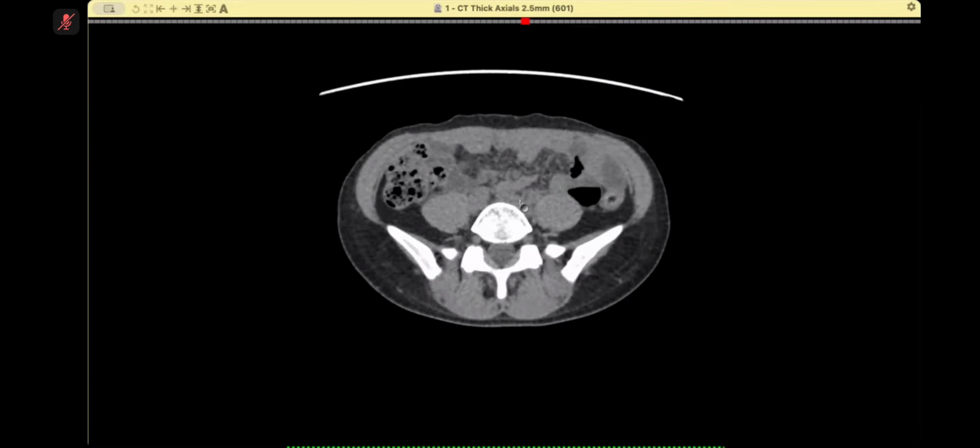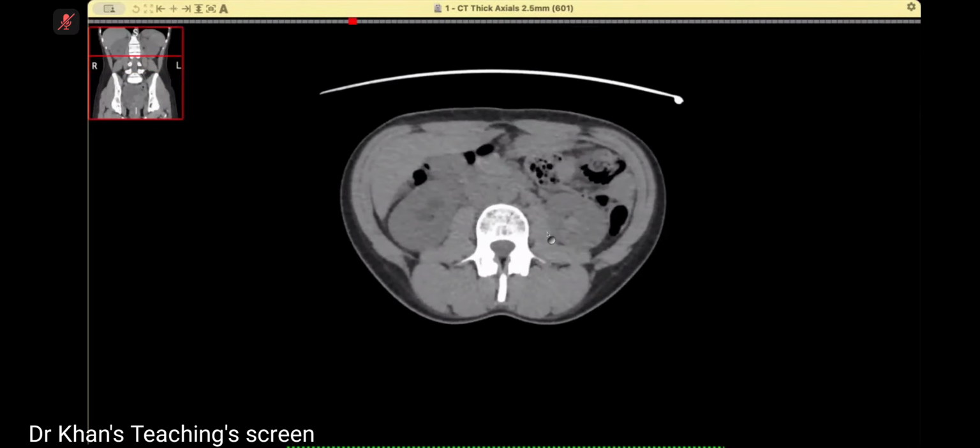One is PID, second is ruptured dermoid, and this patient could have been that, but the counter argument is that in a ruptured dermoid or ruptured ectopic, usually you will not see this kind of hydronephrosis. So it was slightly more long-standing. So dermoid or ruptured dermoid, PID, ectopic, these are the top 4 in the gynae world, and endometriosis, of course.